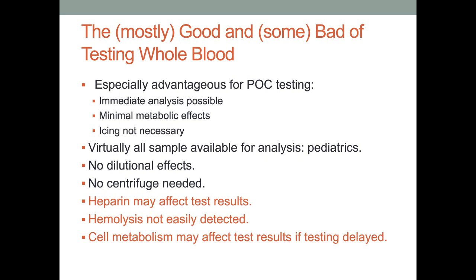Heparin can affect results depending on how much we fill the tube. If we fill the tube half full, we double the heparin concentration or any anticoagulant or glycolytic agent in the tube or syringe. With whole blood, hemolysis is not easily detected — a very significant issue. Cell metabolism may affect test results if testing is delayed; if there is any delay, you will get more metabolic effects.